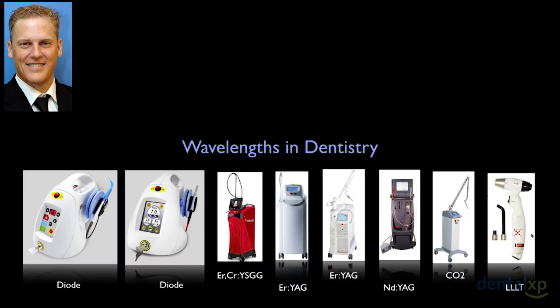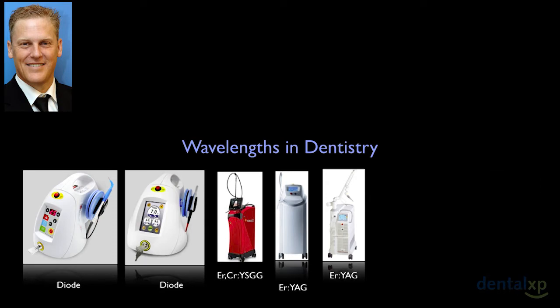There are a myriad of lasers out there, and for sake of brevity, I'm going to focus today just on two topics: the diode laser on your left and the all-tissue lasers on the right. Dr. Stephen Brown, who's in the third row, will talk about the Nd:YAG laser and the exciting role of it in periodontal disease and also for the treatment of peri-implantitis tomorrow.